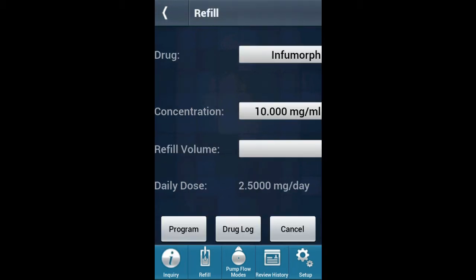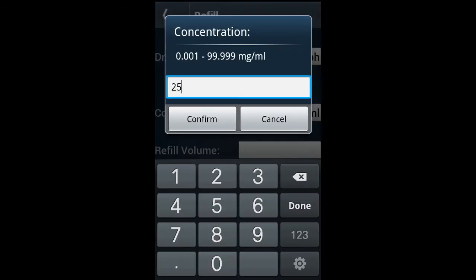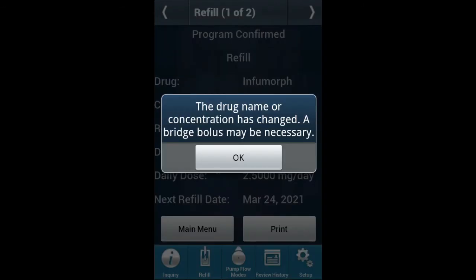The refill screen will appear. Drug and concentration will auto-populate with the previous settings. Here you can enter in the new concentration. After the refill has been programmed, a message stating the drug name or concentration has changed — a bridge bolus may be necessary — will appear. Please click OK and proceed with the following steps.